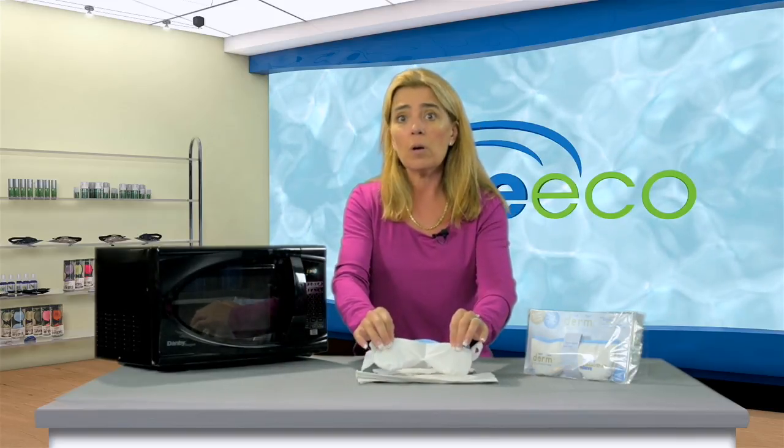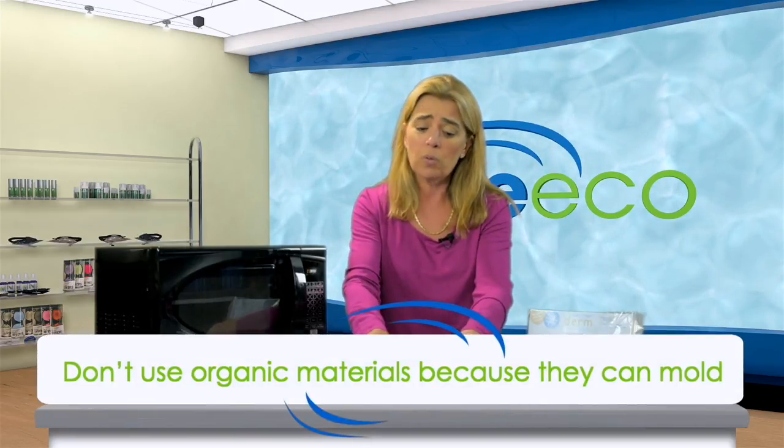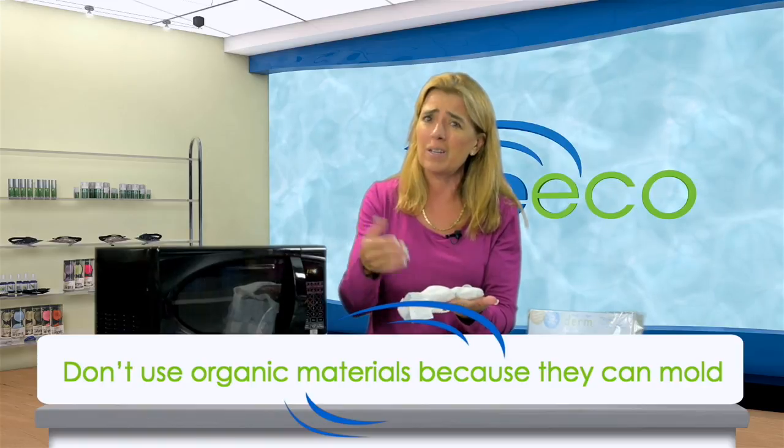One, we want a safe material. As a footnote, we use silica because it is inert and inorganic. And as much as everybody loves organic things, we want to make sure that we don't put organic materials on the lid — they can mold.